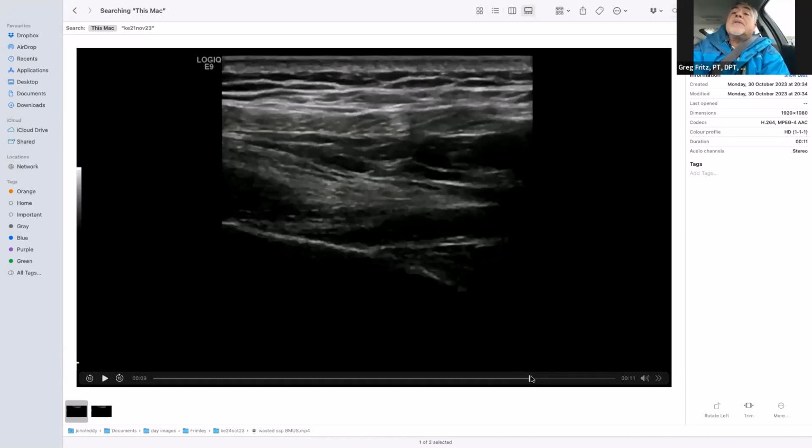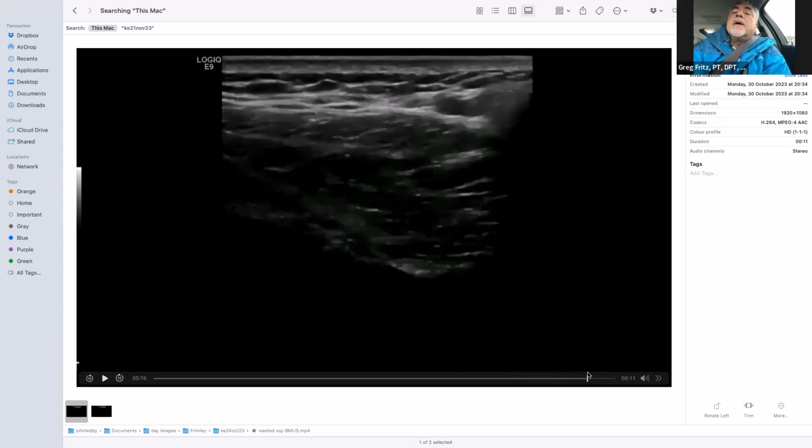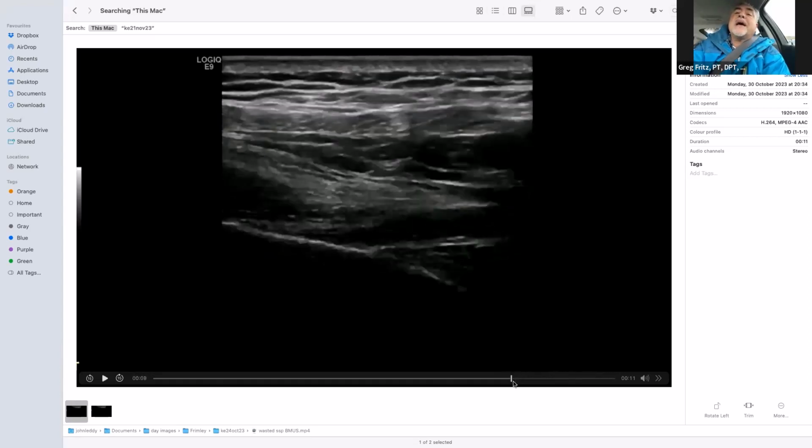How are you confident? I mean, I know you are, but how can a refined sonographer's eyes pick out the nuances in the picture that verify it as fat? It's not just anatomy. You're actually looking at it going, well, that looks like fat.